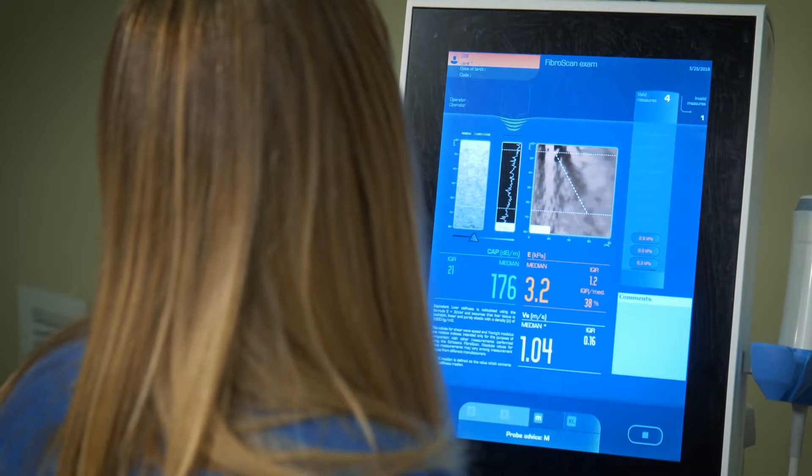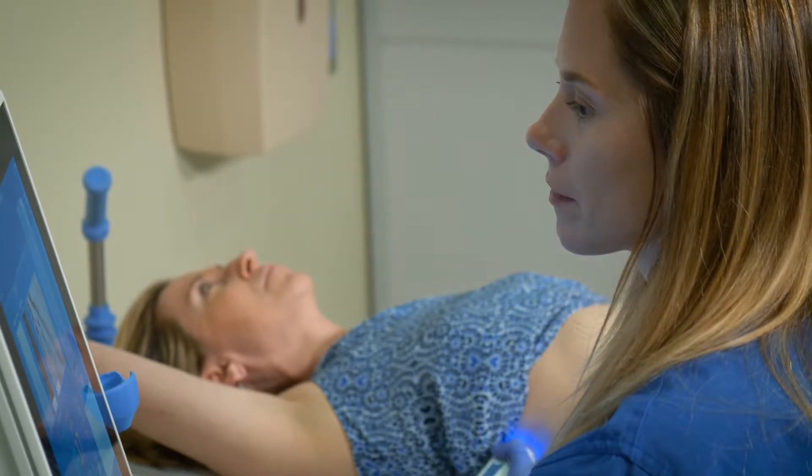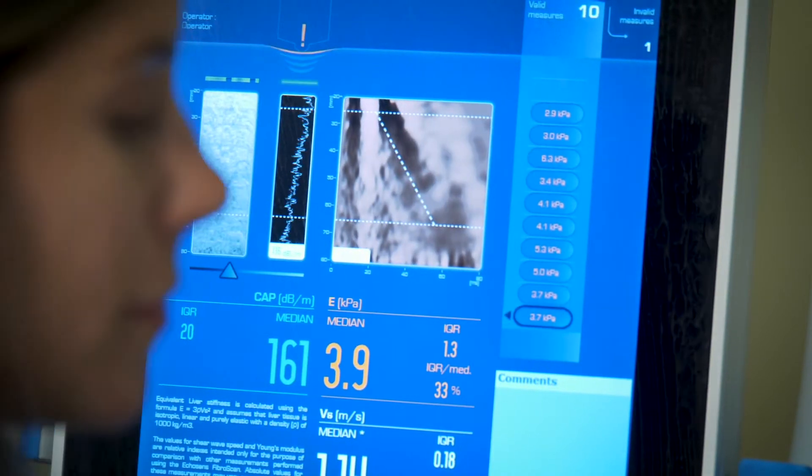Once the probe is in the right position, pressing a button sends a vibration wave to the liver. The machine reads the vibration wave — the speed of the wave as well as the attenuation of the signal. We usually take ten measurements and the result is the average of those ten. You get the results instantly.